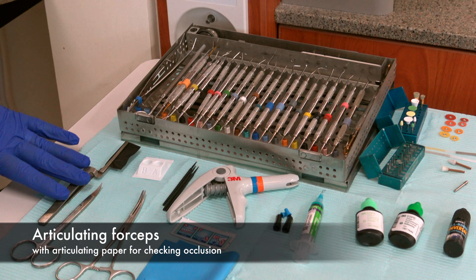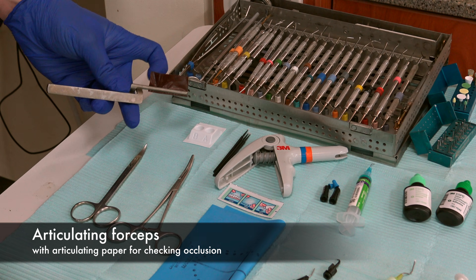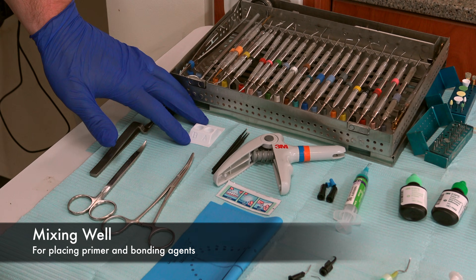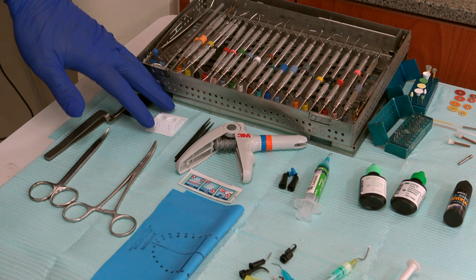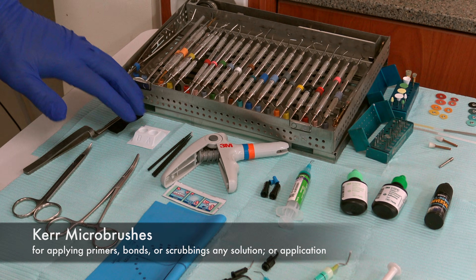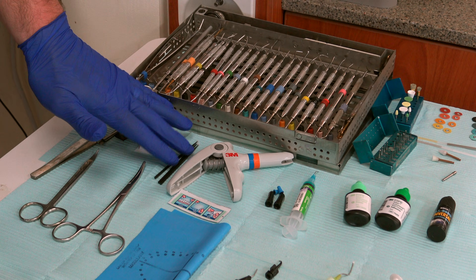Here we have articulating forceps with a little bit of articulating paper in there for checking occlusion. We have scissors and hemostats that came from the operative cassette. We have a mixing well for mixing our primer and adhesives as we etch, bond, and adhere the composite to the tooth.